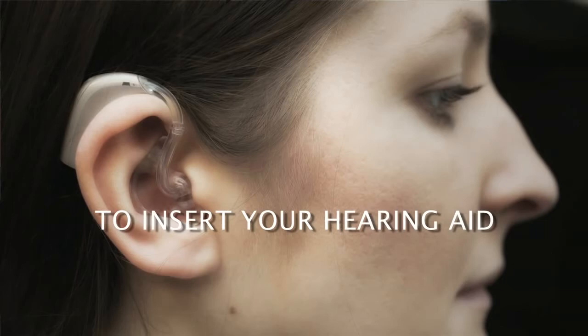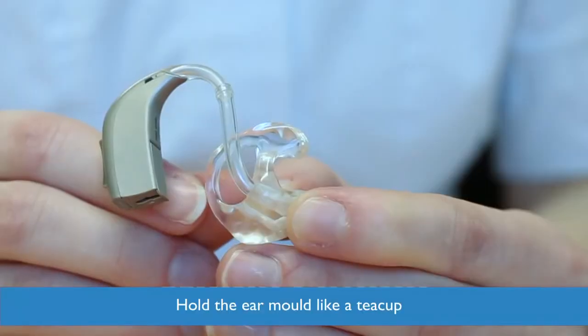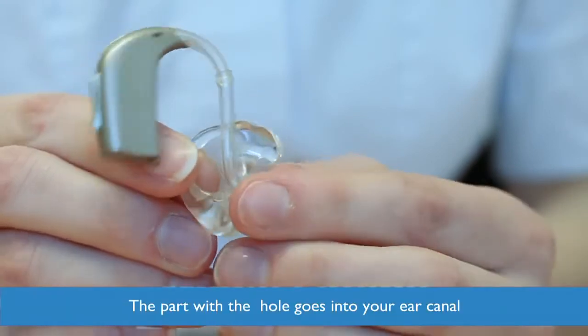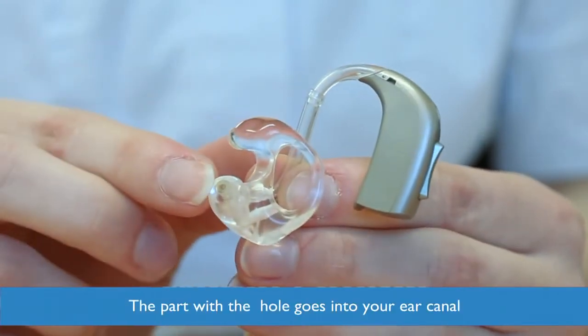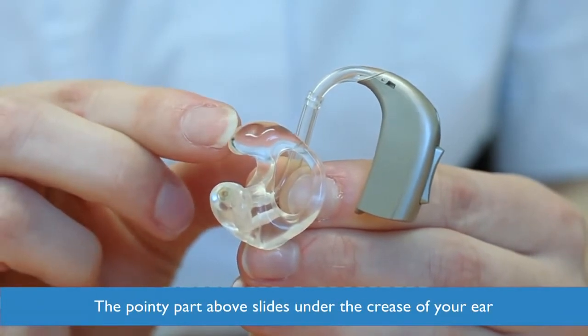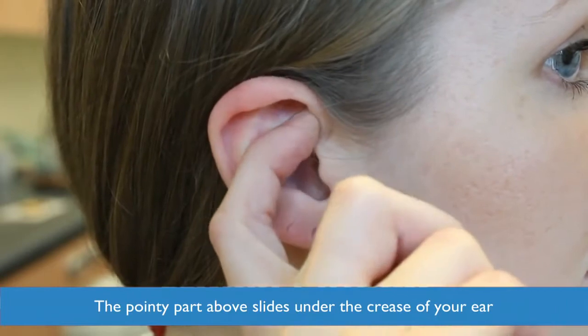To insert your hearing aid, hold the ear mould like a teacup. The part of the mould that has the hole for the sound is to be inserted into your ear canal. The pointy part above slides under the crease of your ear.